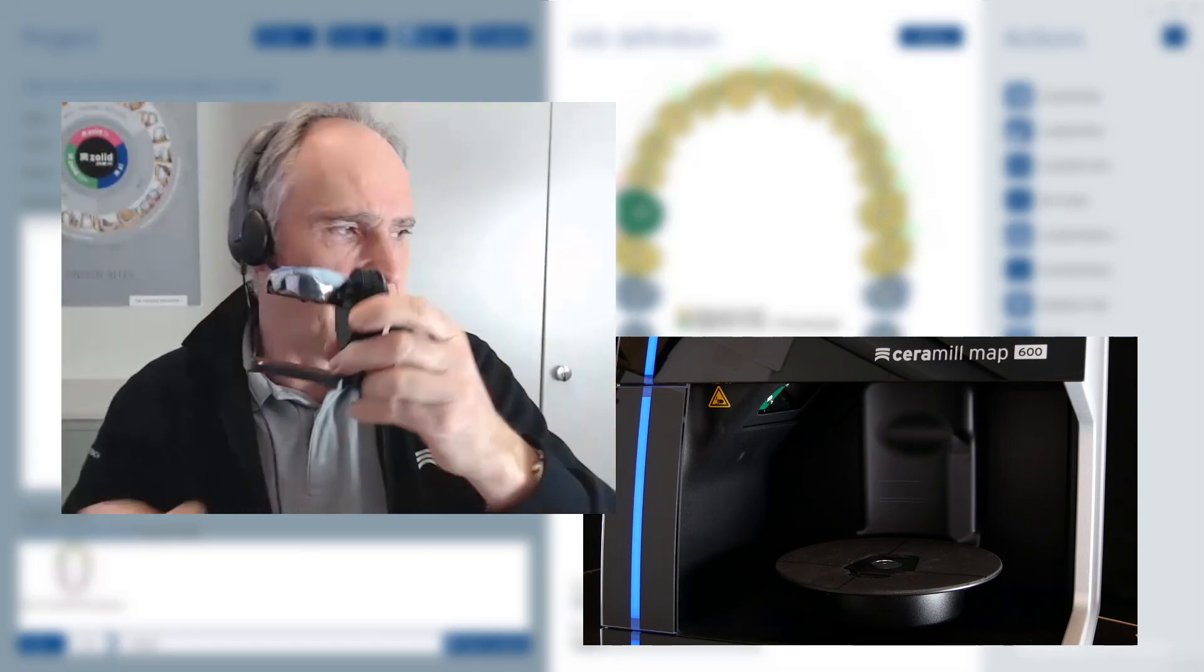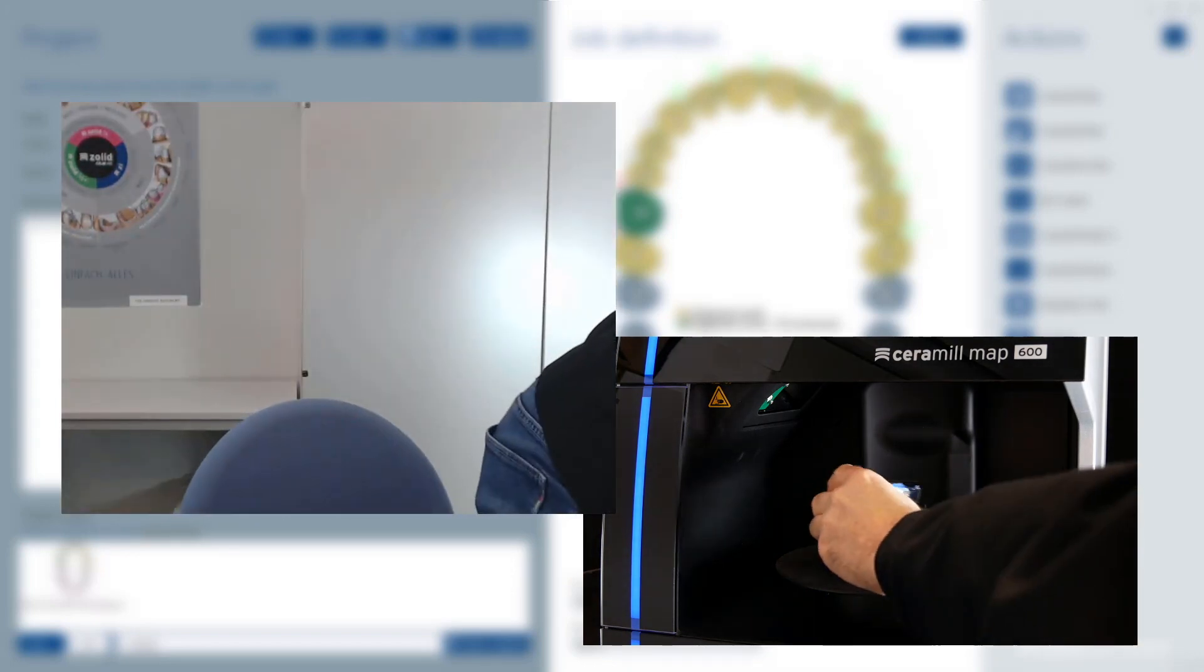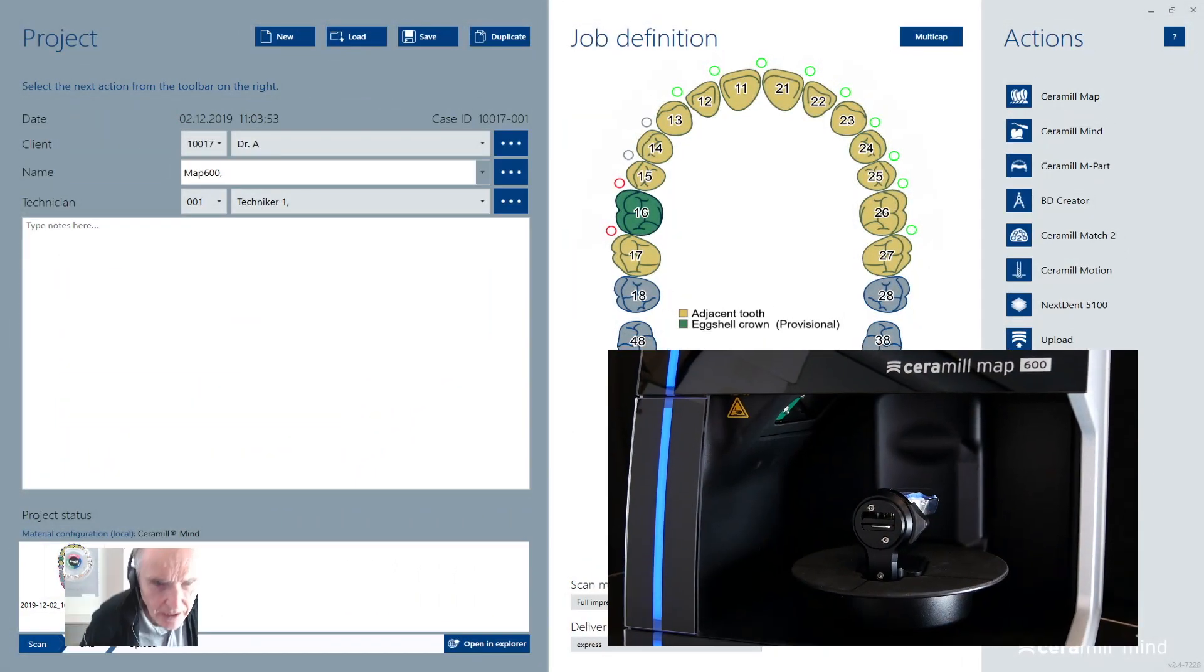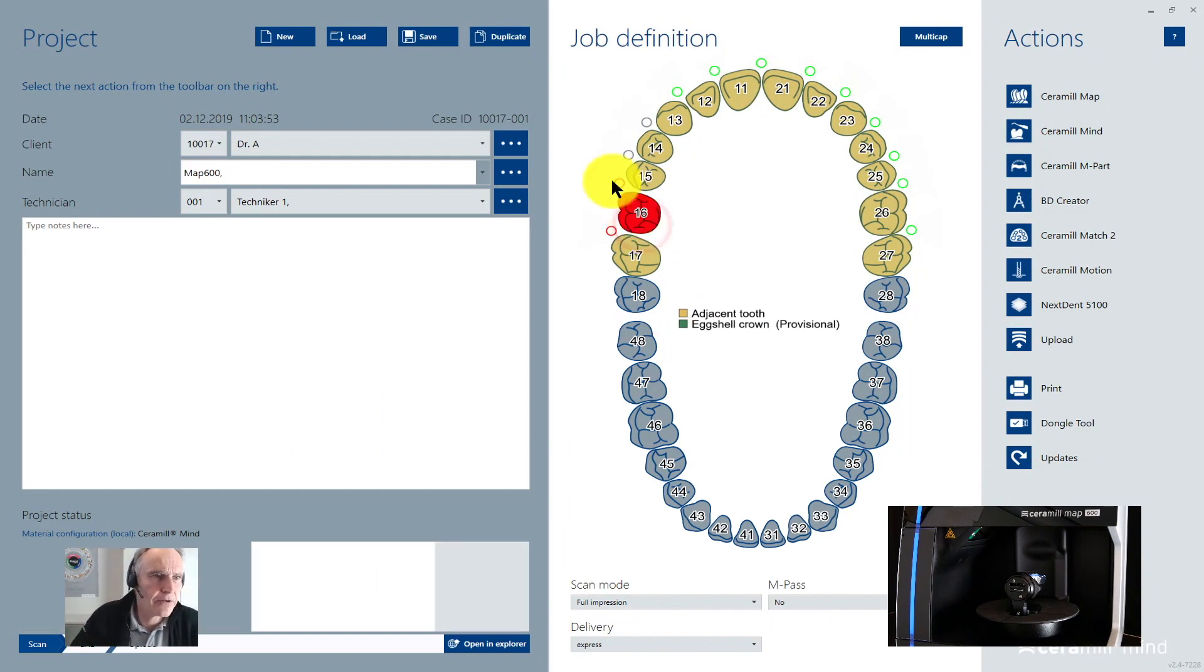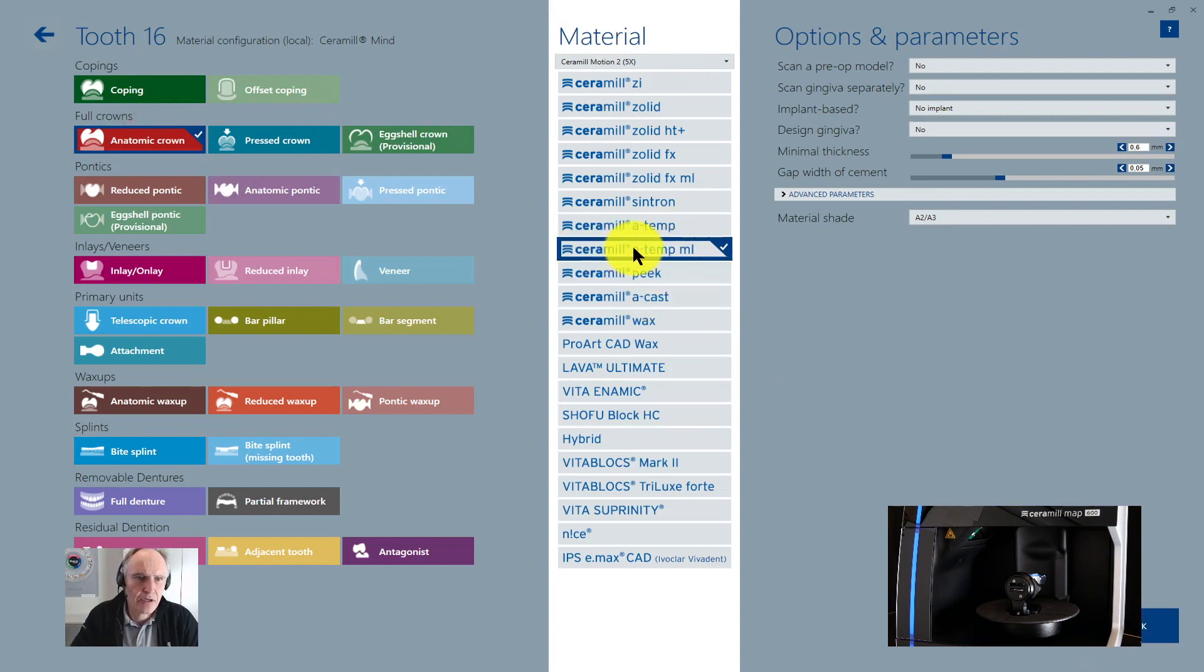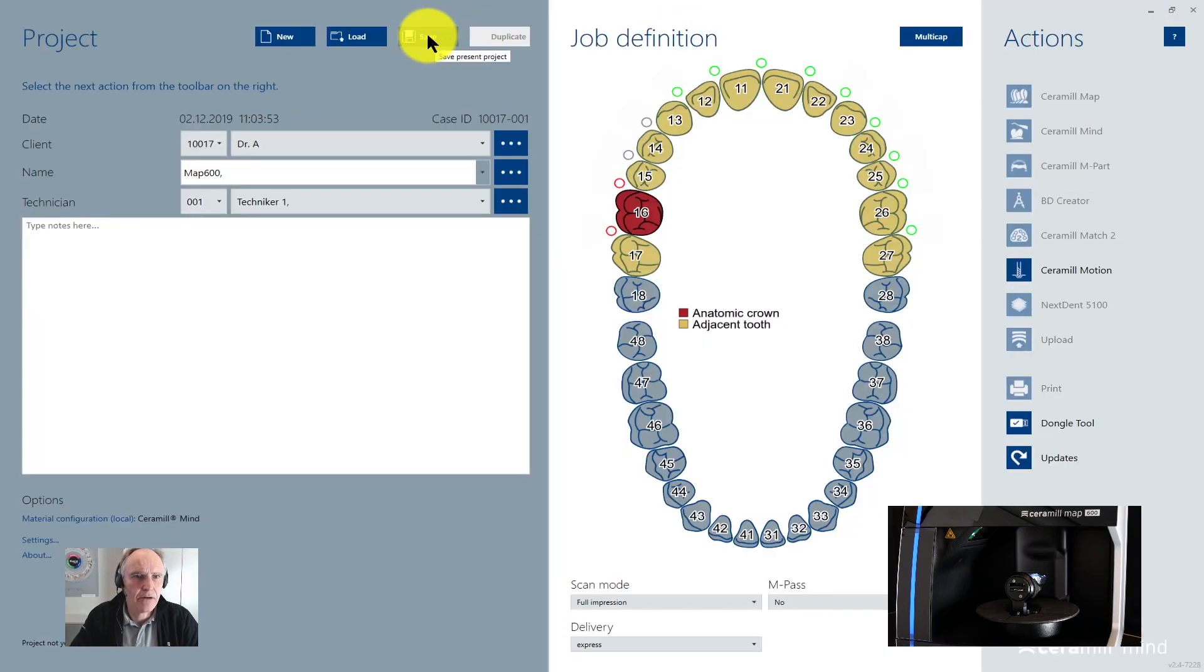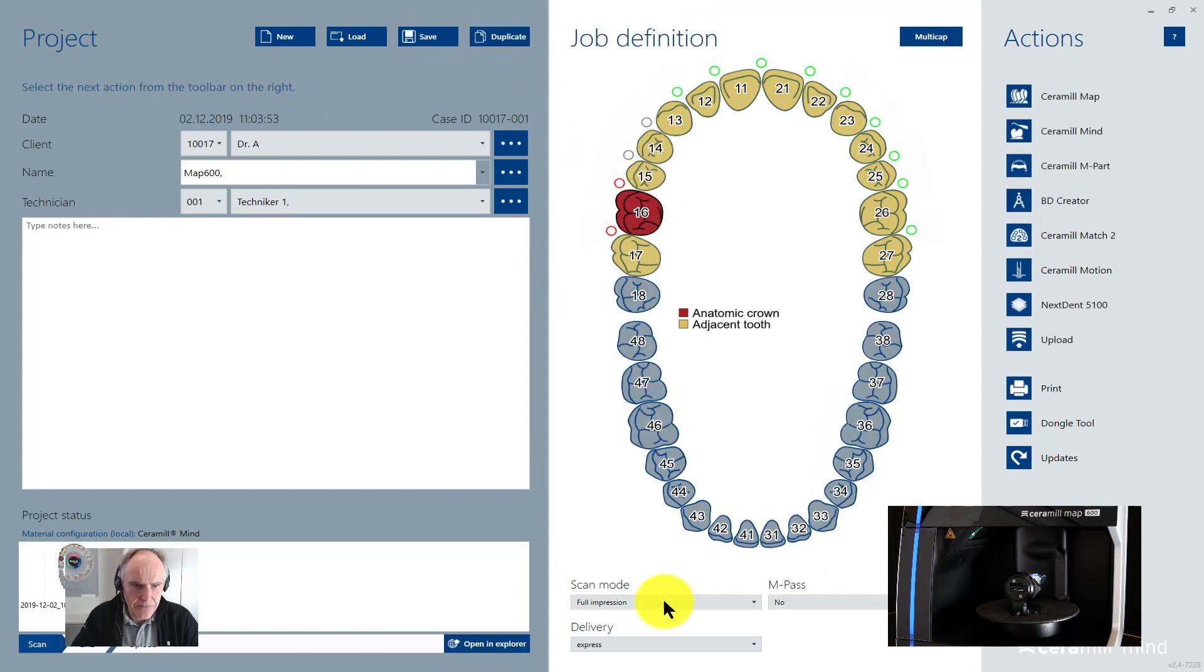Then you go in your scanner and you are preparing your indication, for example, let's have an anatomic crown or a coping. Then here we have chosen a temporary material for PMMA. Then now we want to click on ok and click on save. We don't have any antagonists.